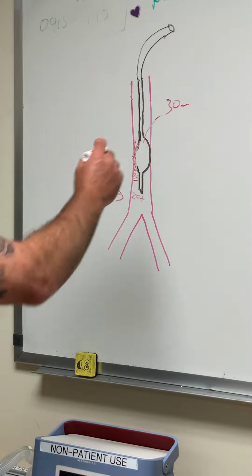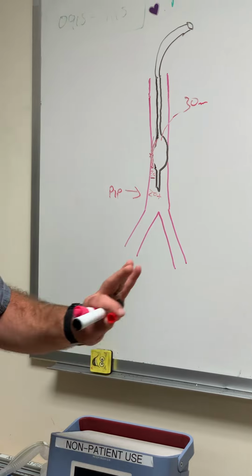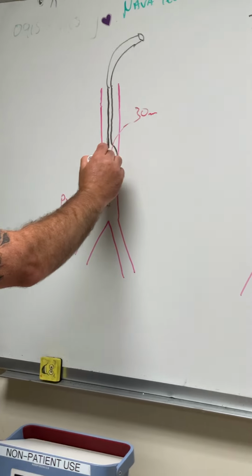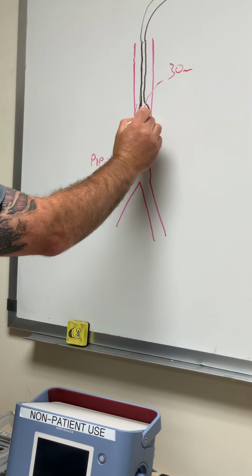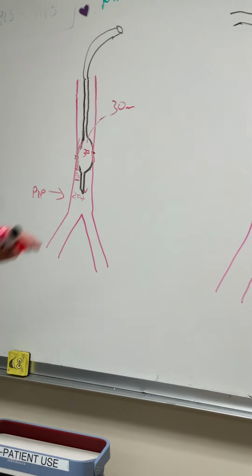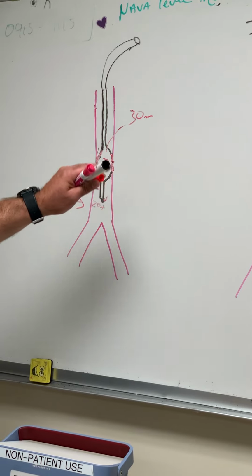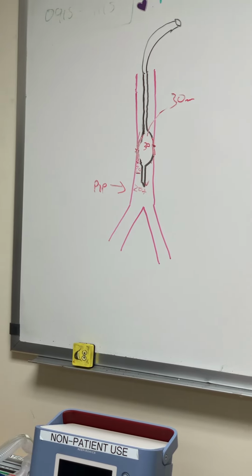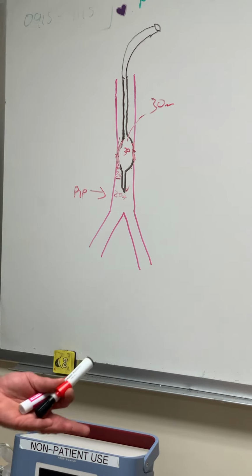Basically what will happen is you're stretching the cuff past its normal limits and pushing it larger so it can just make contact with the trachea here. And it's taking 30 of pressure inside the cuff to get it to touch the tracheal wall, if you will, and produce a force of 20 below the cuff itself, right? So when this happens, we're to notify the physician, because almost exclusively the problem would be caused by an airway being too small. Let's say they put a cuffed endotracheal tube in like a 12-year-old kid or an 8-year-old kid or whatever it is.